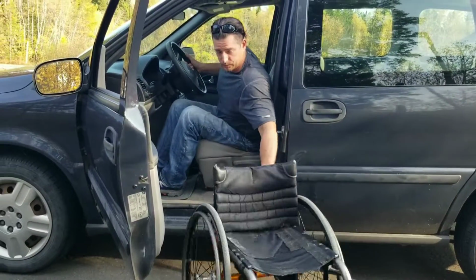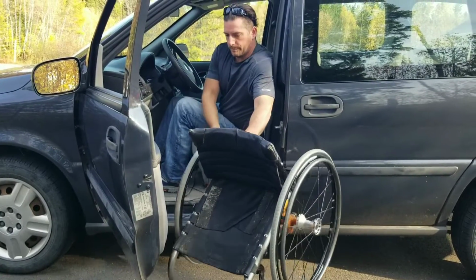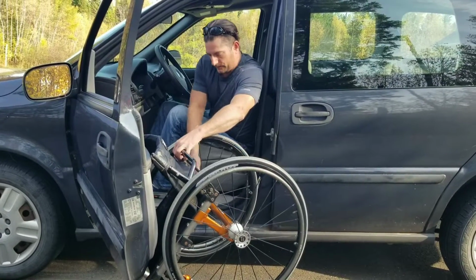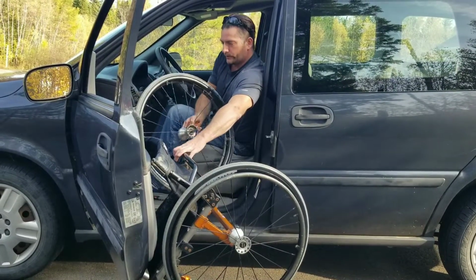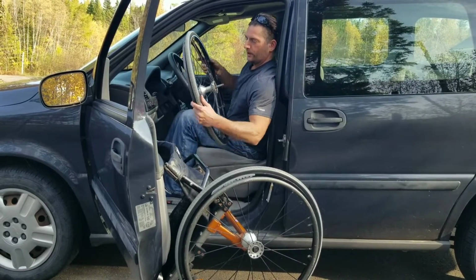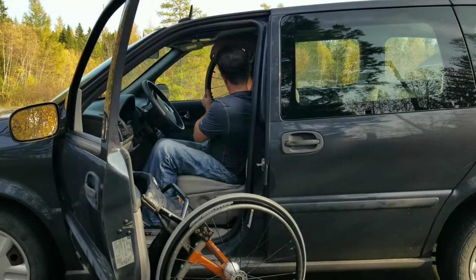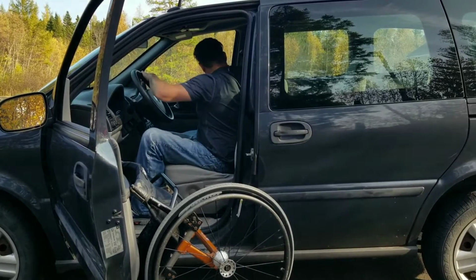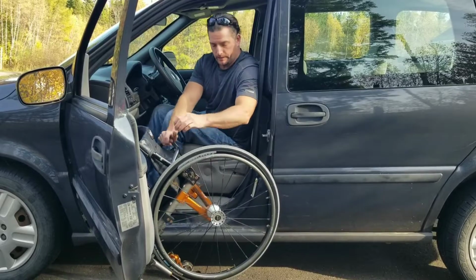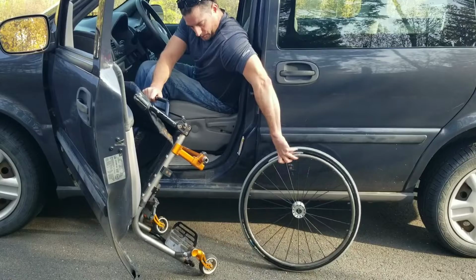So I turn the chair around this way and I lift it up. Now I have pretty good balance, so I'm going to put the chair up against the car door like that, so I can take off the right wheel. There's a quick release button, and the wheels will easily come off. Then I'm going to put this in behind me where I can grab it when I get back out. And then I'm going to put this wheel against my door here.